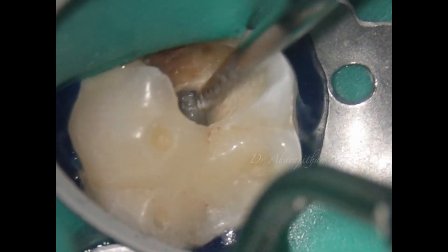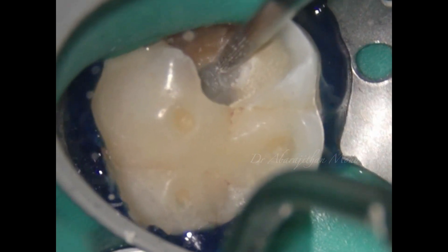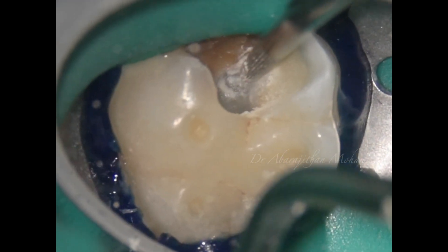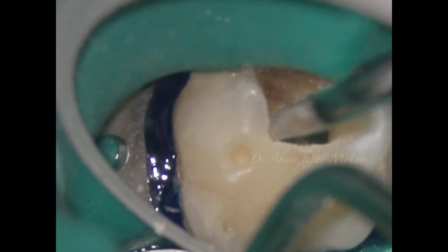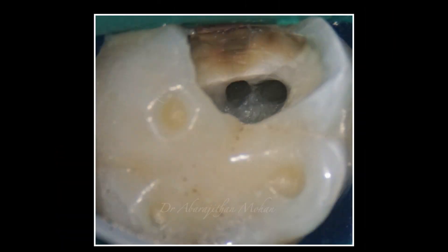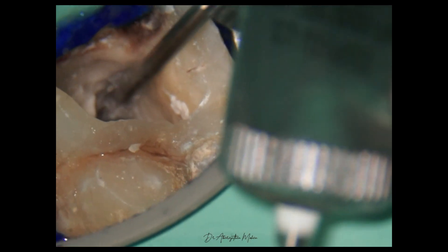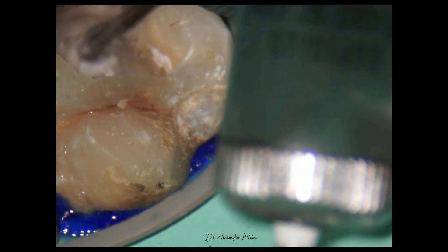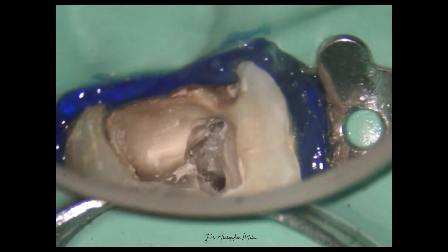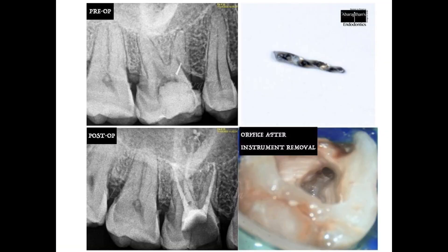In one of our previous videos I also spoke about the importance of ultrasonic instruments for refinement, and many people asked for an alternative since ultrasonics can be really expensive. These situations — to remove the dentinal shell over these MB2s — can also be done with these long neck burs in a much more economical way compared to ultrasonics. Also, these can be extremely useful, especially the purple one which is very tiny — it can even be used during instrument retrieval to expose the instrument before the use of ultrasonics.